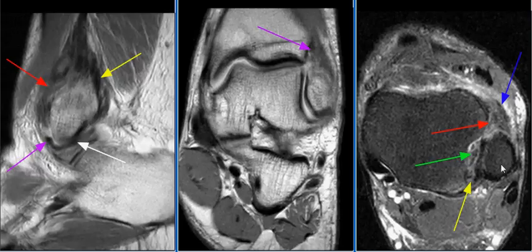Also noted is an intrasubstance split of the peroneus brevis tendon, just inferior to the lateral malleolus. MR findings are consistent with anterior syndesmotic impingement.